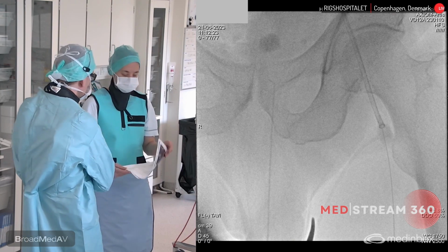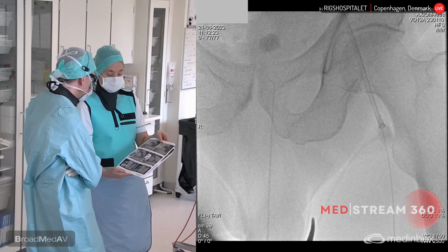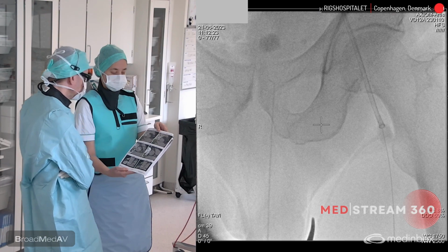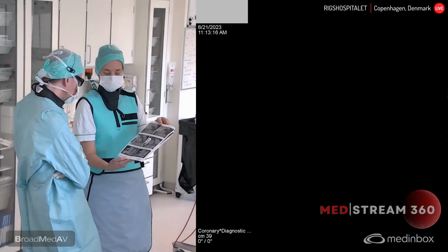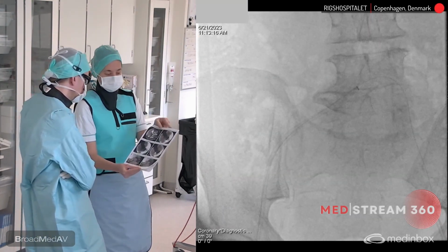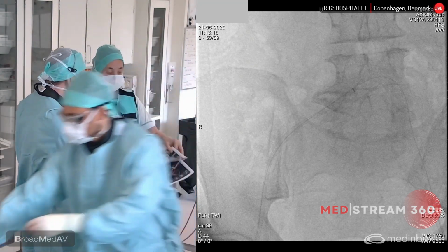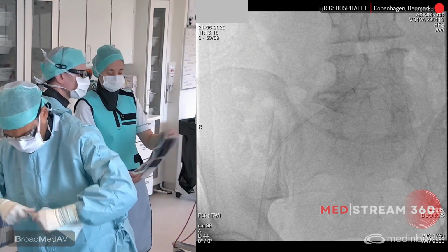And then on the anatomy, he has a very calcified tricuspid aortic stenosis. Just to give you some idea about the sizing, he has a perimeter-derived mean diameter of 25.5. Tricuspid, as said, coronary heights are all above 12 millimeters, so no concern for that. The aortic root angulation is kind of neutral, 45 or 50 degrees. Actually, there's a little touch of horizontality in it. And then the axis is pretty calcified.